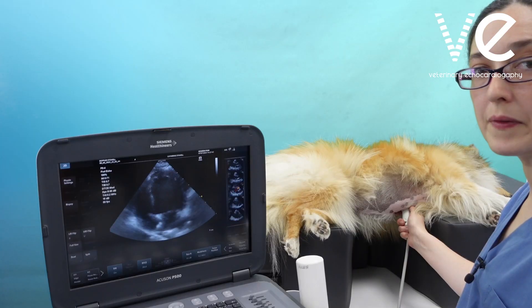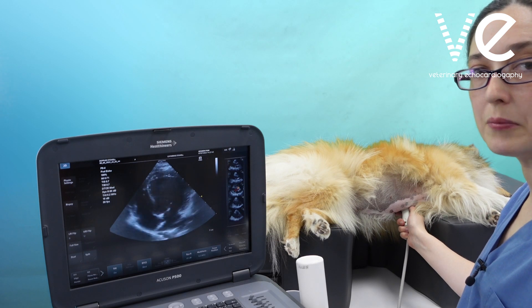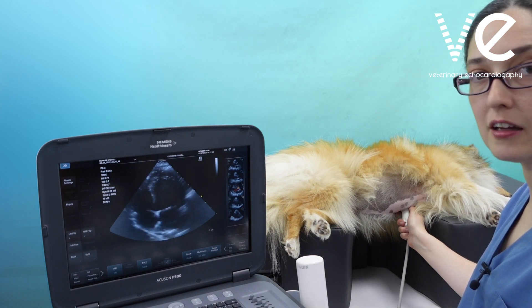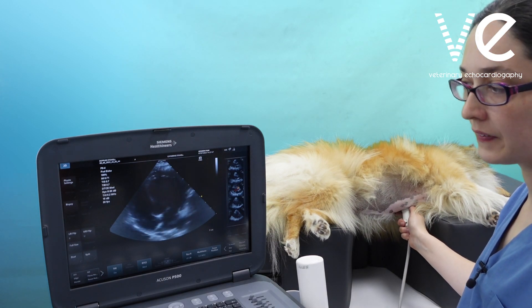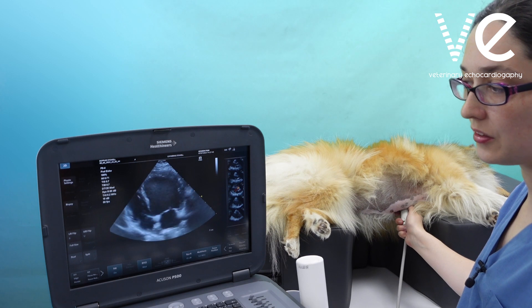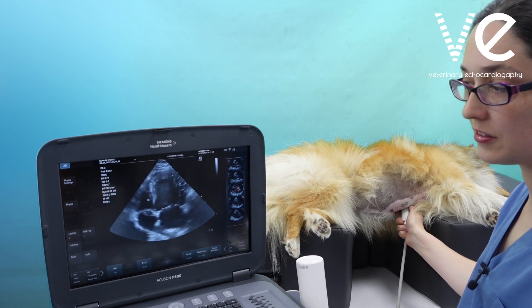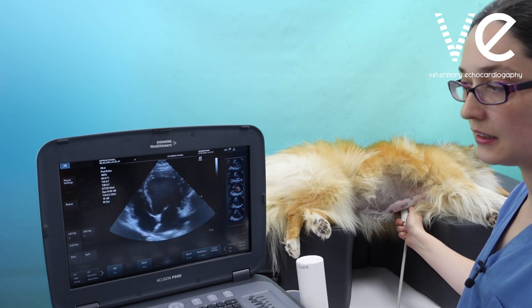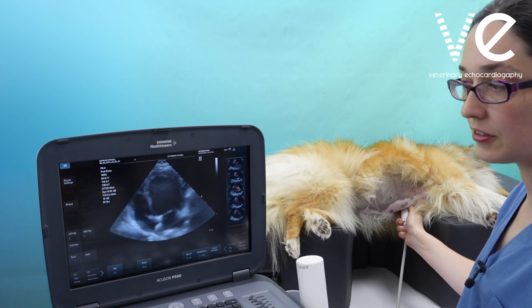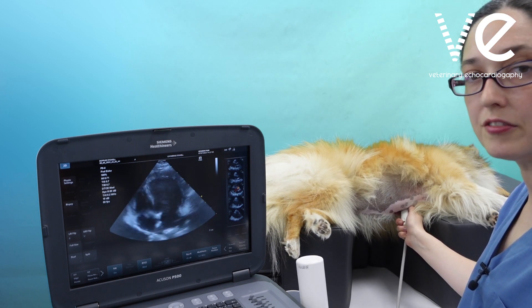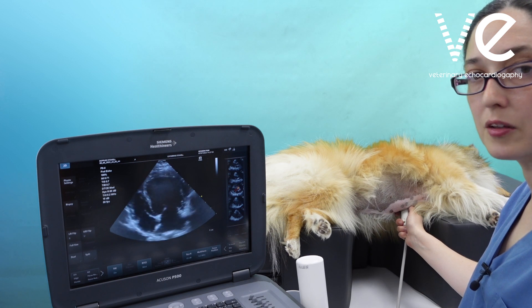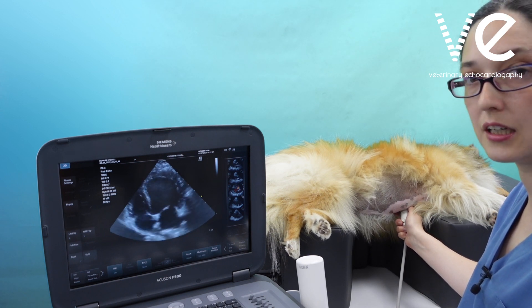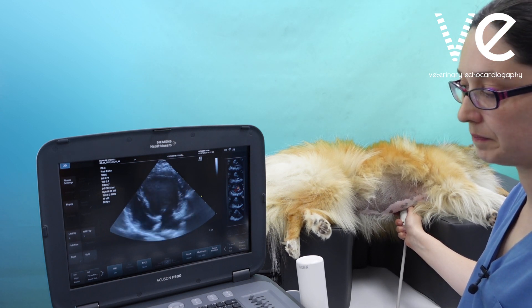From the apical four-chamber view, look again for signs of dilatation of the left ventricle and also assess left ventricular systolic function. An ejection fraction of less than 50% is a poor prognostic sign in patients with aortic regurgitation.